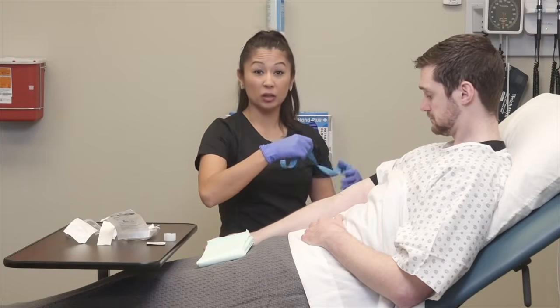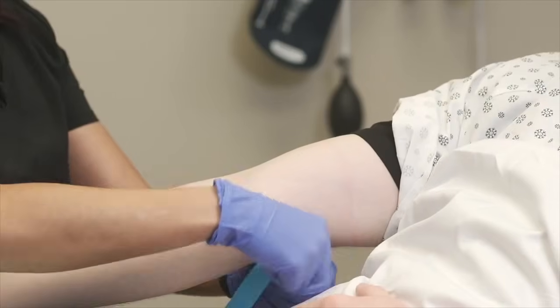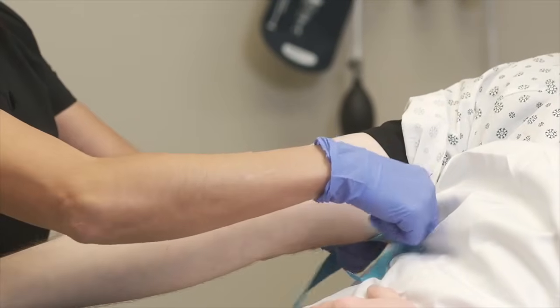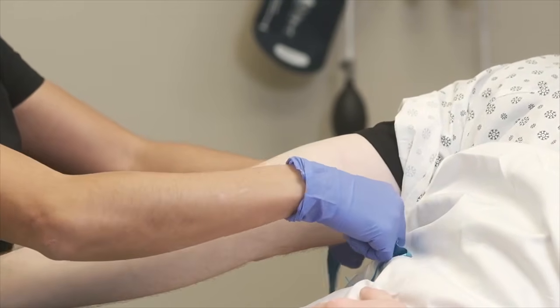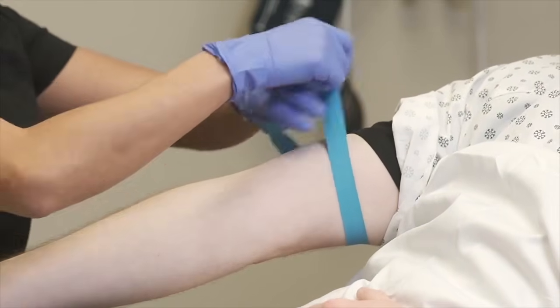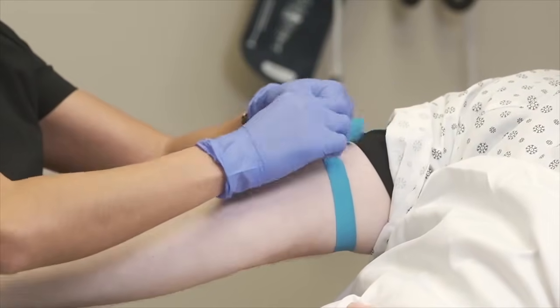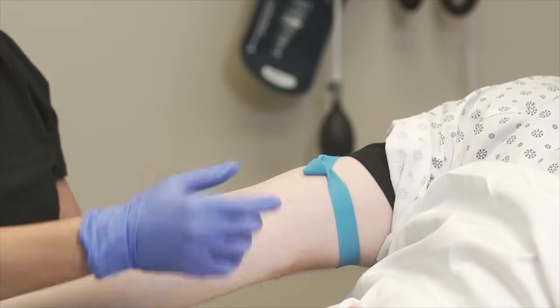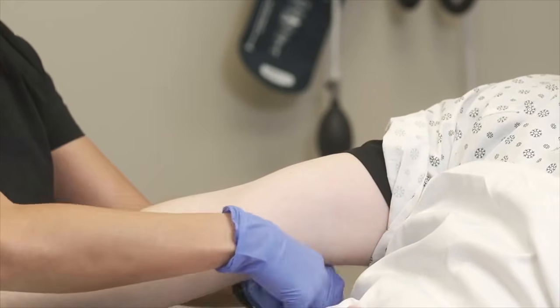Students typically struggle a little bit with this skill, so this is a nice thing to practice. So I'm going to put this underneath the patient arm, and again, the closer that you put it towards the patient arm, it makes it much easier to keep it nice and tight. What we don't want is a very loose, as you can see, tourniquet, because what is that doing? Not a lot, right?